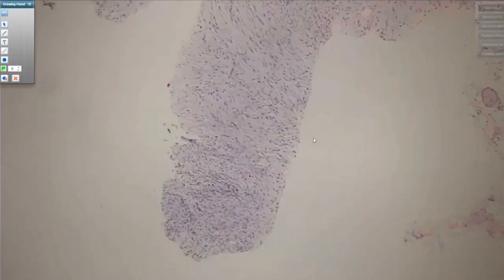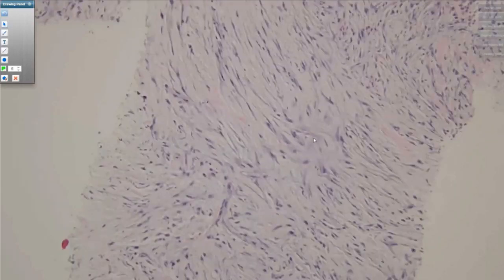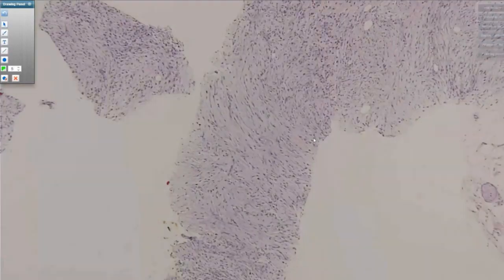So when you have a core needle biopsy of a bland spindle cell proliferation in the breast such as this, the first thing you need to think about doing are cytokeratins. Fibromatoses of the breast, as in other sites of the body, are not immunoreactive for cytokeratins. In this particular example, cytokeratin immunostains are performed. I have them here.